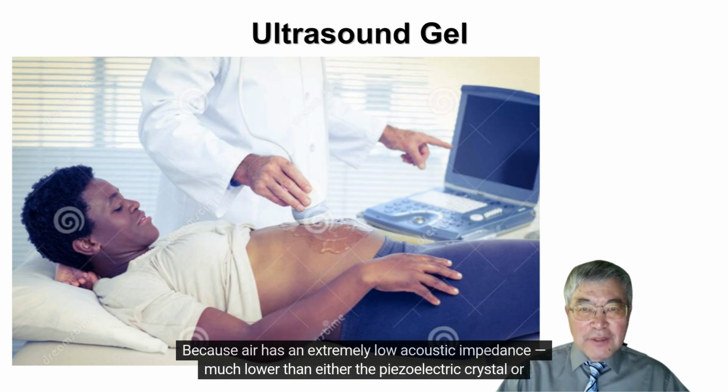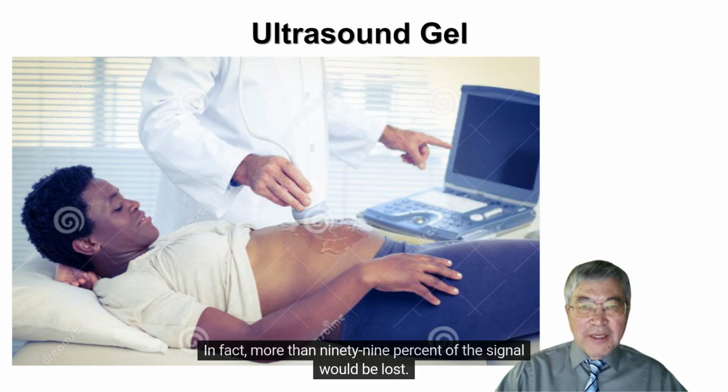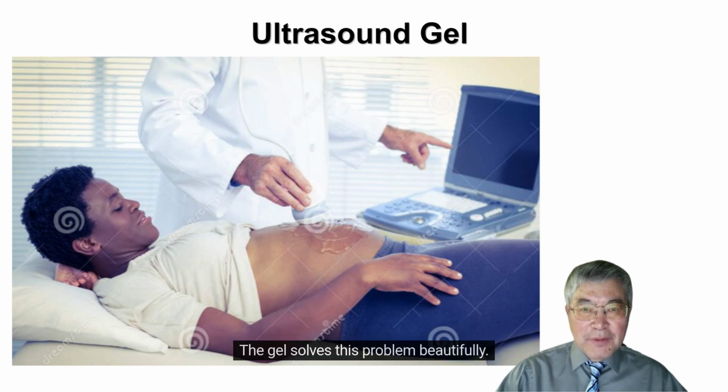Because air has an extremely low acoustic impedance, much lower than either the piezoelectric crystal or human tissue. When an ultrasound wave tries to go from the crystal into air, almost all of the energy reflects. In fact, more than 99% of the signal would be lost. So the ultrasound beam would never enter the body. You'd see nothing but noise on the screen. The gel solves this problem beautifully.